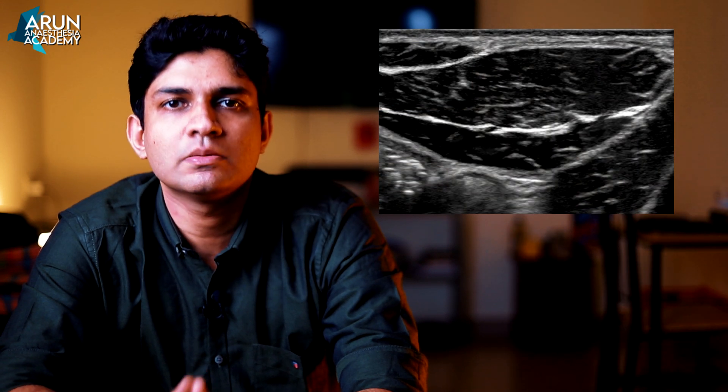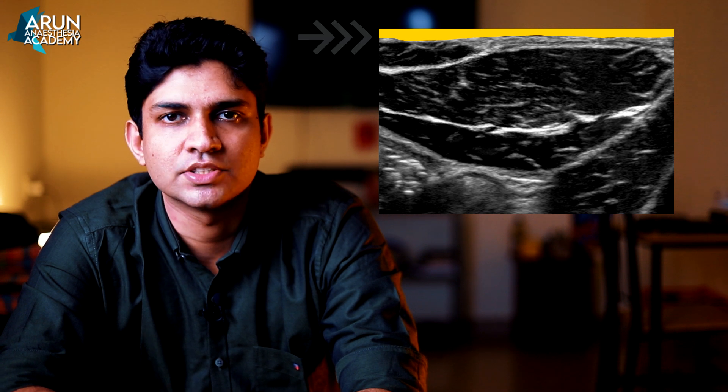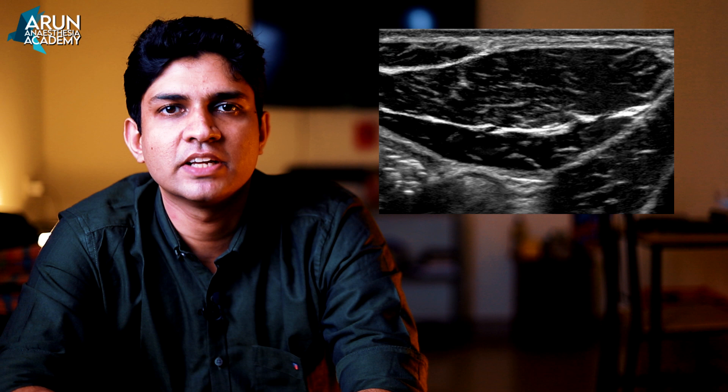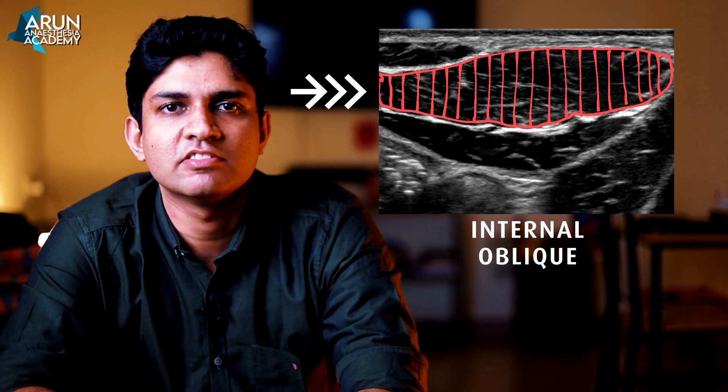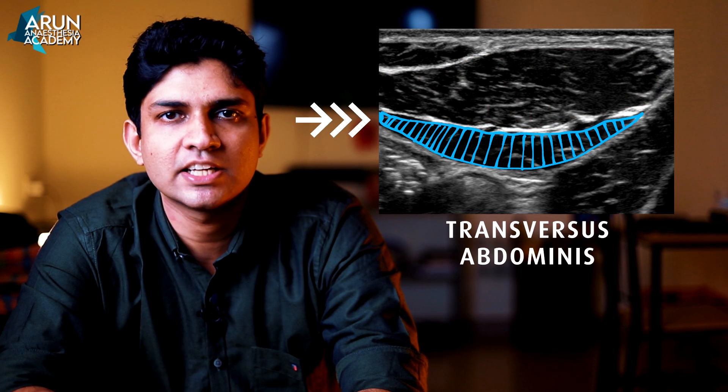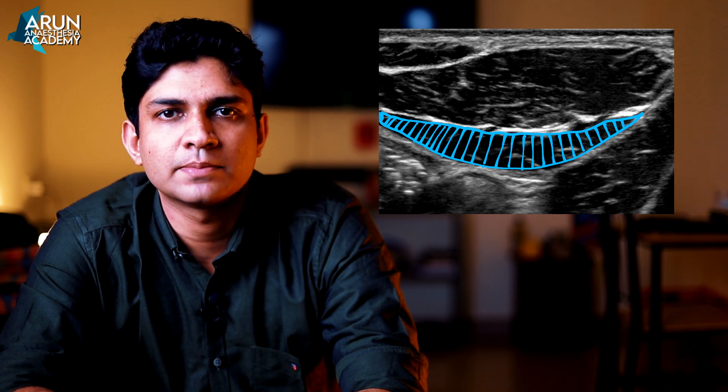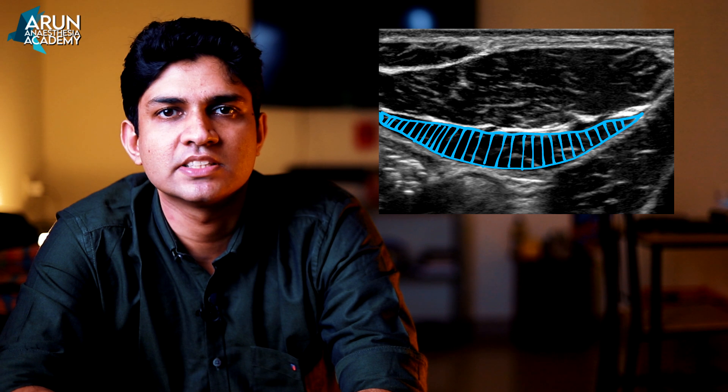Scanning is done with the patient in supine position using a high-frequency linear transducer probe. One end of the probe is kept medial to the anterior superior iliac spine, oriented on the line joining the anterior superior iliac spine and the umbilicus. The structures visible from superficial to deep are: subcutaneous tissue, then the three muscles — external oblique, internal oblique, and transverse abdominis. The internal oblique is the thickest of the three, and the transverse abdominis is the thinnest. Deep to the transverse abdominis we can also see the transverse abdominis fascia, similar to what we see in the TAP block.